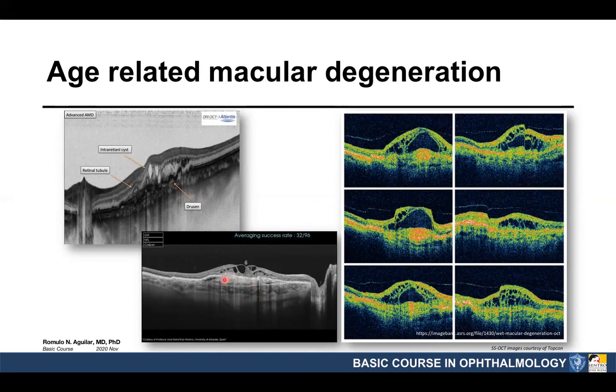You have here the thickening, the choroid, most likely your choroidal new vessels. You have cystic changes, and again, here it's probably a choroidal new vessel. In the colored picture, the highly reflective areas are your choroidal new vessels, and you have cystic changes or disruption of your layers.